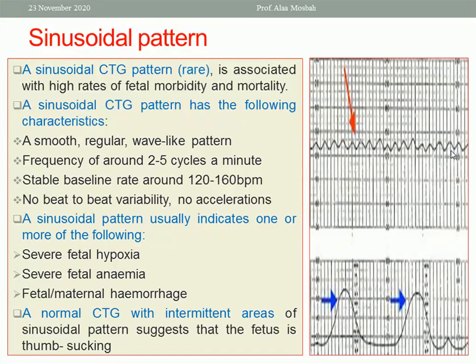So it is something physiological due to sucking by the fetus. Otherwise, sinusoidal pattern is dangerous, indicating severe fetal hypoxia or anemia or fetal or maternal hemorrhage.